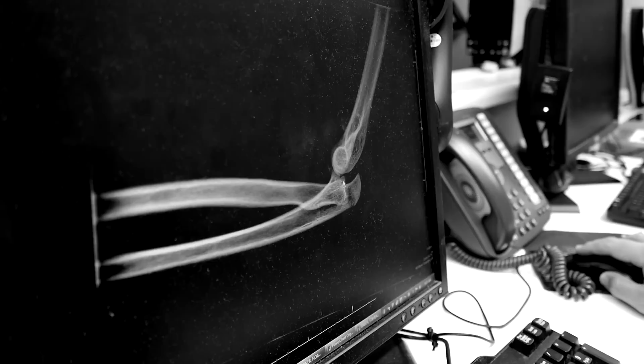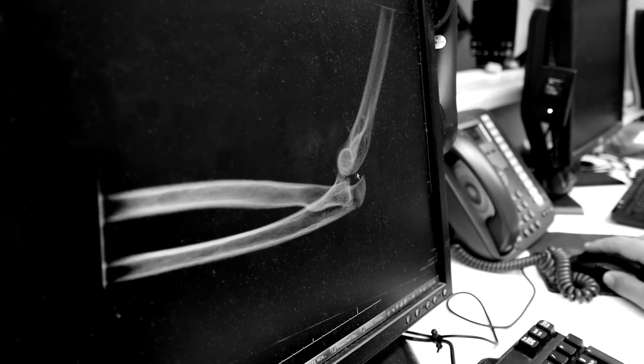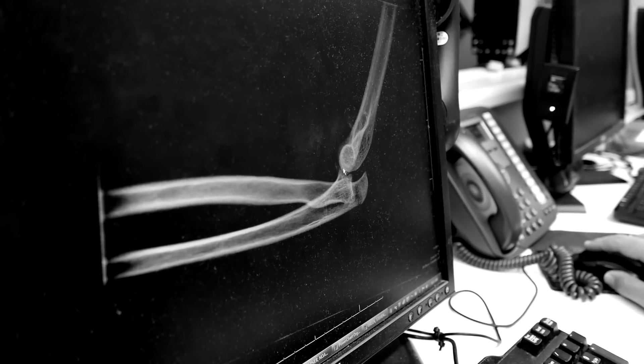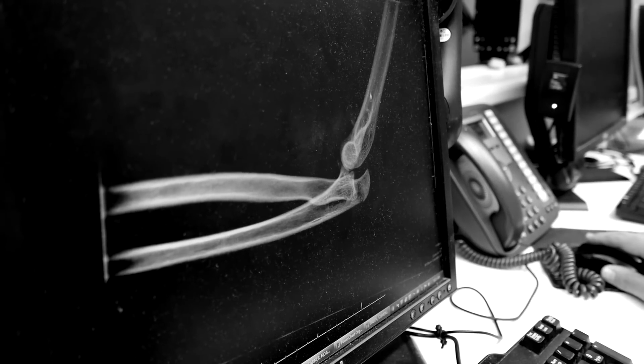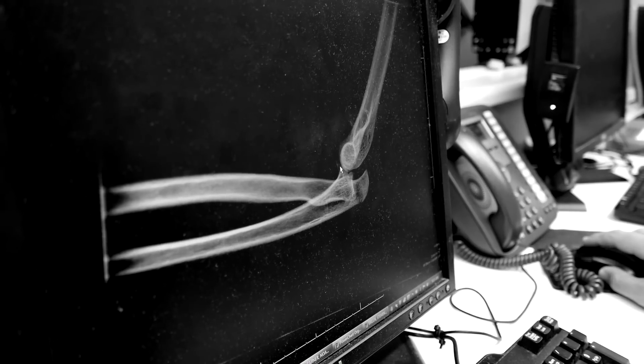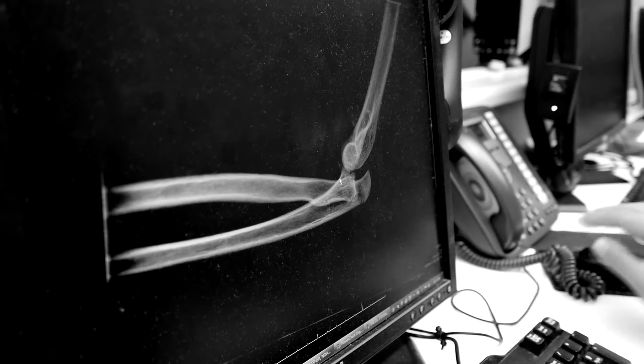It's in line in the coronal plane — you can see on the AP radiograph. The radial head is supposed to articulate with the capitellum here as well, so I think they're both out. It looks like it's perched right there on top of the coronoid. The plan is to apply traction with some counter-traction and slide the olecranon right back onto where it's supposed to sit on top of the coronoid.